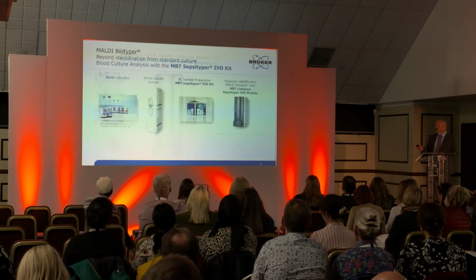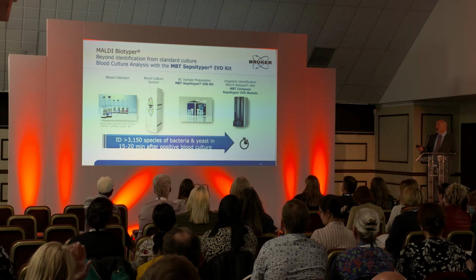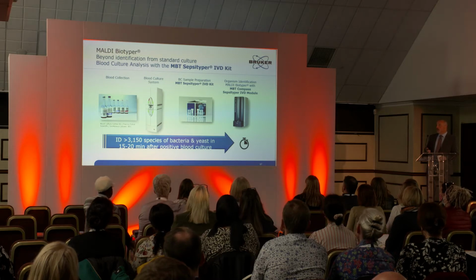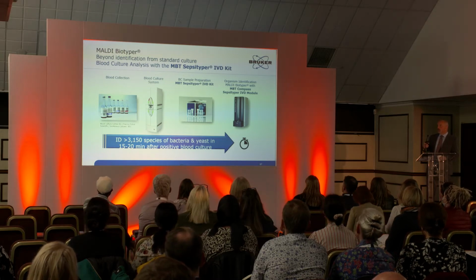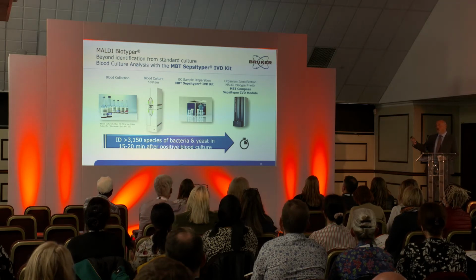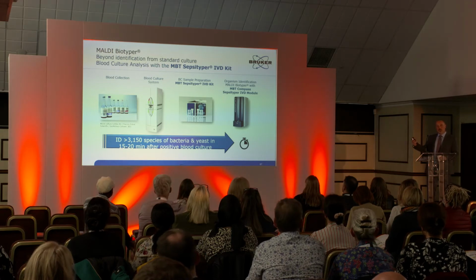So there you go. When we focus on the sepsis pathway and the blood culture pathway, as you know, you would take blood cultures if you suspect sepsis, send it off to the laboratory, you incubate the bottle in a blood culture incubator, and then normally what you would then do is take some of that blood culture, put it onto an agar plate, grow it for another 24 hours potentially, and then run an ID.